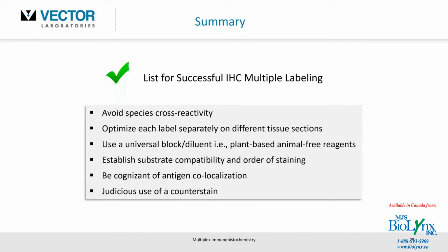And that way you wouldn't inadvertently use an incorrect serum, for example, and get false positive staining or indeed blocking of your detection. Certainly establish substrate compatibility. I did show you some of the charts earlier on, and the order of staining.